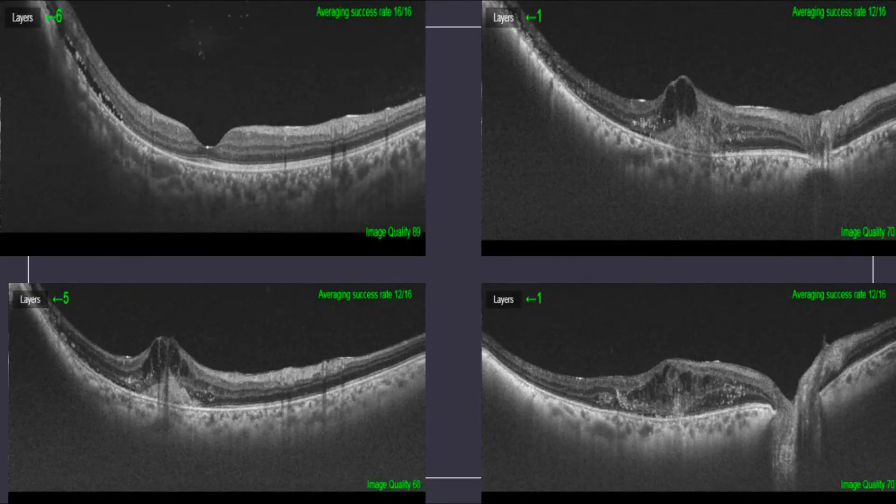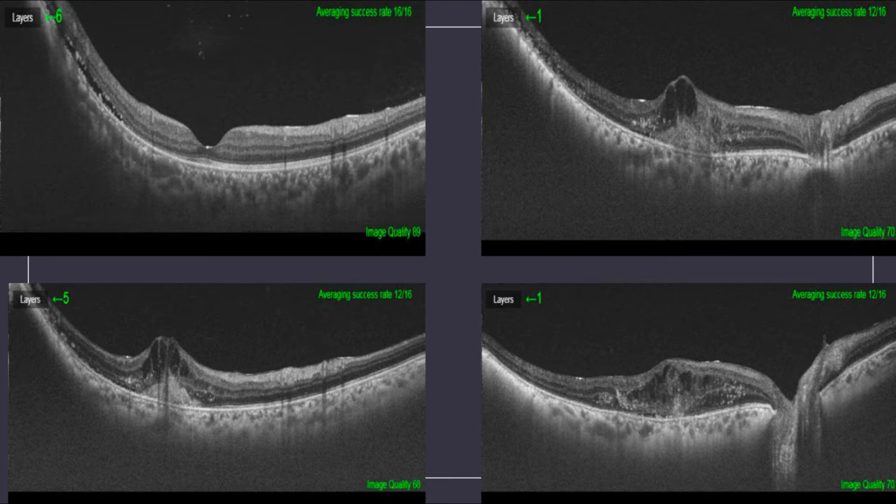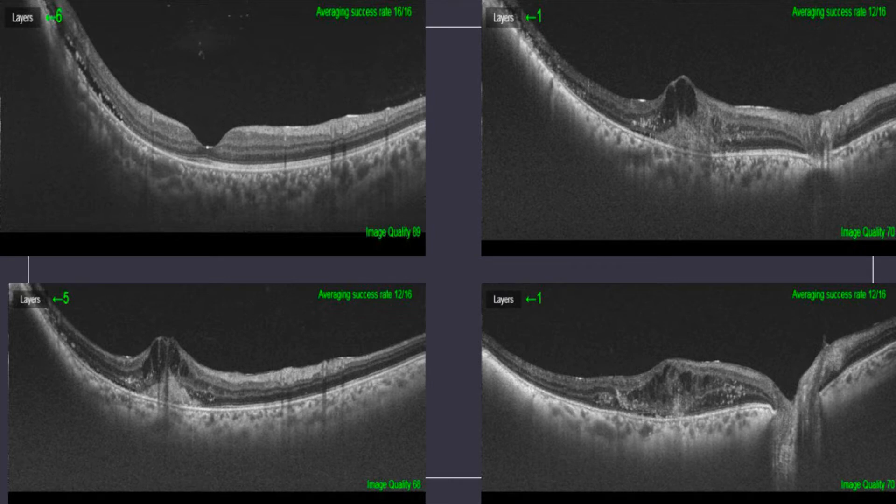This picture shows us the worsening of the edema from the initial presentation even with the intravitreal steroids. The diagnosis of a toxic tumor syndrome was made and the patient was posted for endoresection of choroidal melanoma under hypotensive anesthesia.